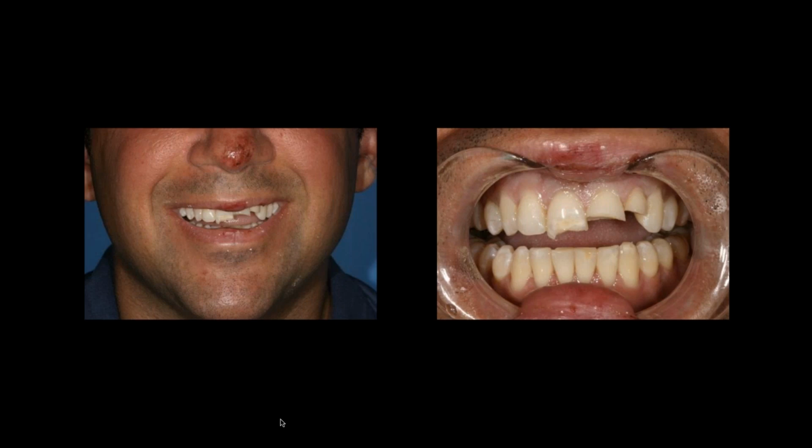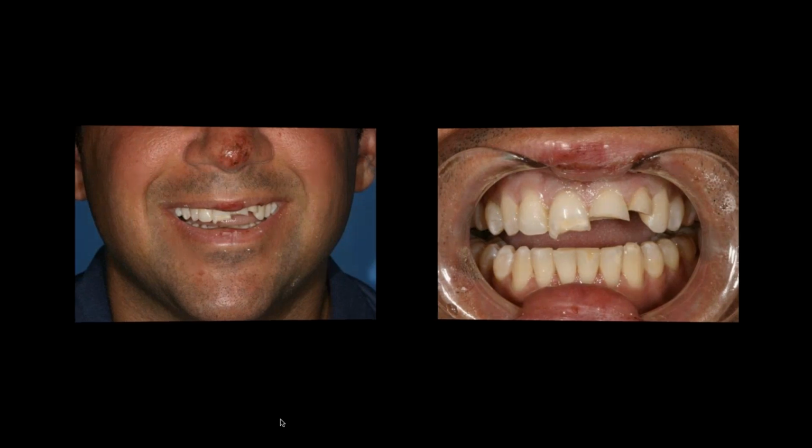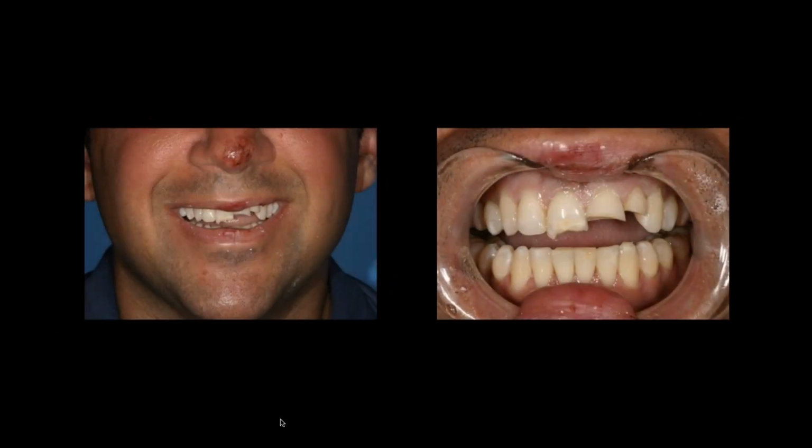I'm dealing with an accident victim who actually fell off a motorcycle, smashed his face on the floor, broke his front teeth. And you can see here that this is going to be a challenge. I know most people see this case and think, oh, we're going to extract the tooth or we're going to prep a 360 and post-core it. We don't think that way today in dentistry. We actually think that if you didn't destroy the tooth functionally, we're going to save as much of the tooth structure as possible. And that's really the goal.